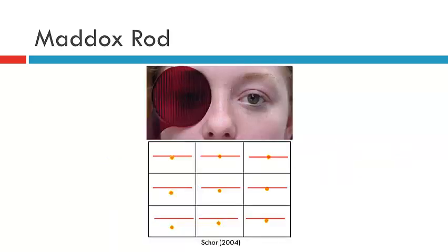Okay, so upon completion of this examination, you'll have asked the patient to indicate to you where the line is in relation to the light in all positions of gaze. And of course, if you've also used the prism, you will have a measurement for each of these positions. Here we see a patient who's been measured in 9 positions of gaze, and we can see where the greatest deviation exists. In this particular instance, the greatest deviation is here in dextrodepression.